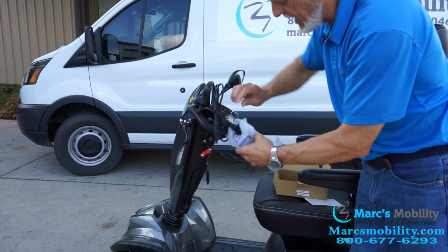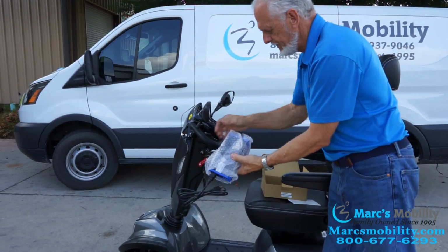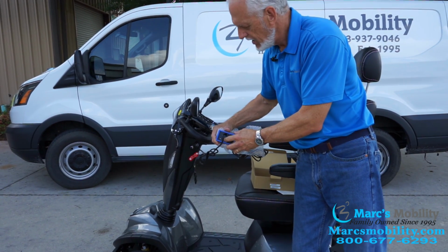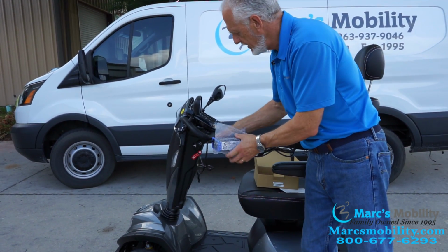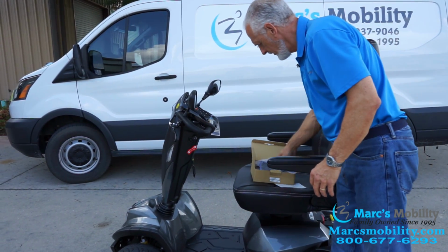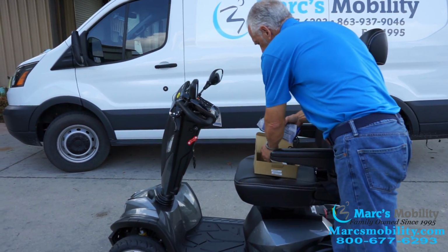And as soon as the light turns green on your charger, there's a light in the back of your charger right here. It'll be orange when it's charging. It'll turn green when it's full. Then the batteries are full, okay? So that's your charger that comes with the scooter.